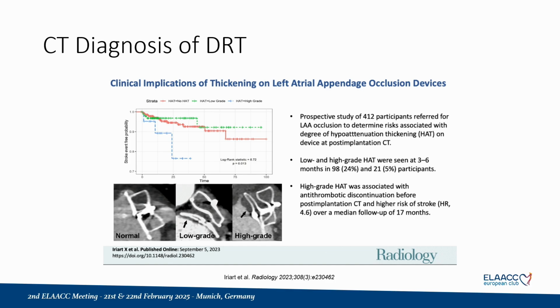Also, Dr. Erik has shown that this classification into low-grade and high-grade changes actually correlate with clinical outcome. And obviously, in my opinion, we need more studies to look into whether our changes, what we see on CT follow-up, is correlating to outcome, worse outcome.